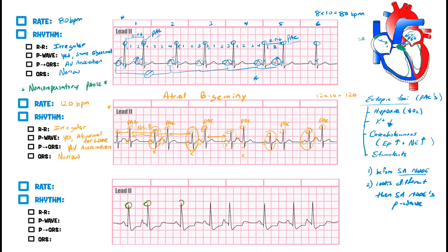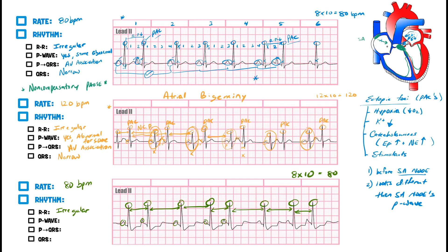Moving to the third EKG: counting R waves — one through eight — eight times ten equals 80 beats per minute. For rhythm, the R-to-R intervals are inconsistent — going short, then long, then short again — so this is definitely irregular.